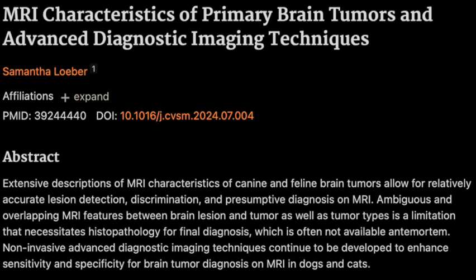Wow, okay. What about those choroid plexus tumors? Anything unique about them on an MRI? Yes, they usually have a very distinct look. They arise from the choroid plexus, which is in the ventricles of the brain. The ventricles being the fluid-filled spaces within the brain. Right. One key feature is that they usually light up very brightly with the contrast dye. So they're like attention seekers. You could say that, but their most interesting and potentially concerning characteristic is that they tend to spread through the cerebrospinal fluid, which, as you know, flows throughout the brain and spinal cord.